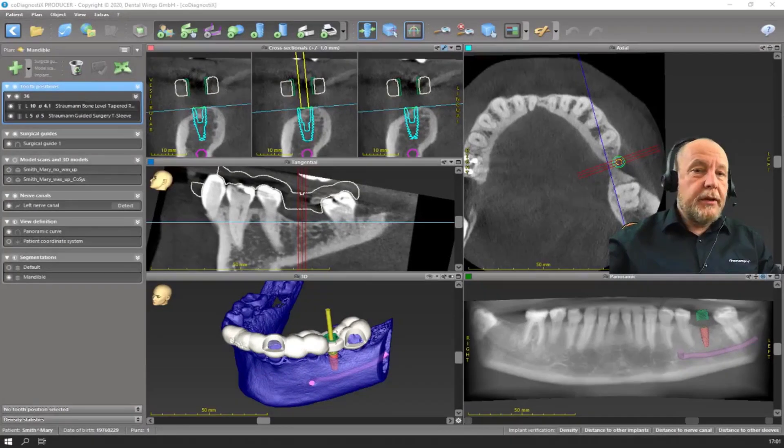One important thing is the cooperation between surgeon and lab. So if you plan your implants, it's helpful that you lock them, and the lab can go on working without any risk.